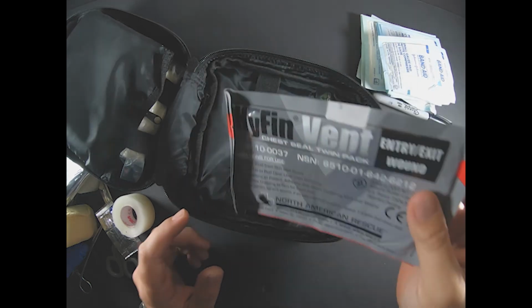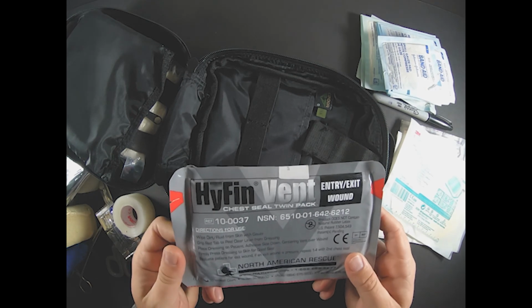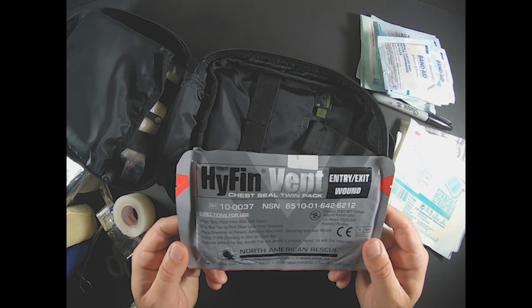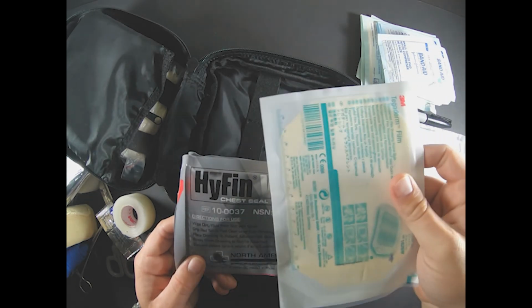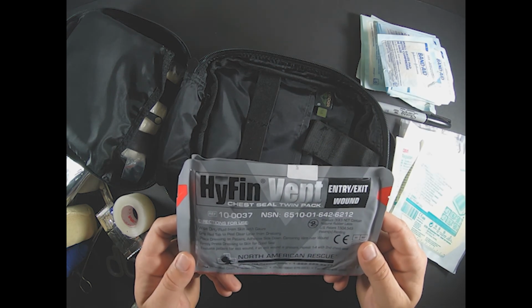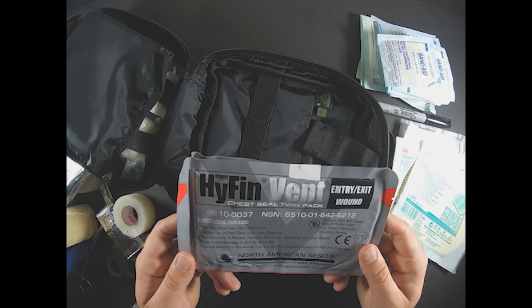And then these are chest seals. With everything going on in the world today, you never know. These are for a sucking chest wound. They could also be used for something very similar, but these are mainly for if for any reason you get shot, you're going to have an entrance wound and typically an exit wound.